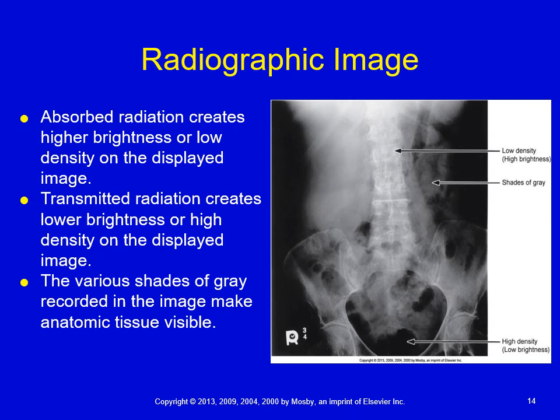If they're penetrating through easily, that means that the X-rays that are exiting at that portion of the image receptor are going to be darker. All right, so the darker areas, like these blacker areas, basically means that a lot more of those X-ray photons were transmitted and reached the image receptor. All right, then we have all of the in-betweens, which we do need. We have all of those different shades of gray.